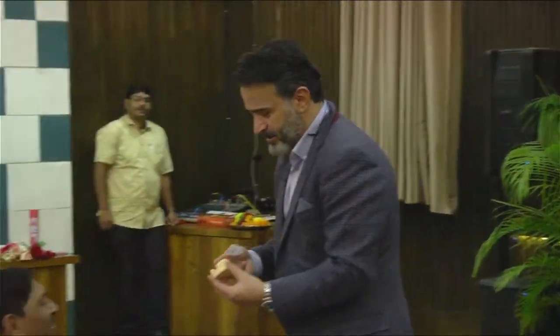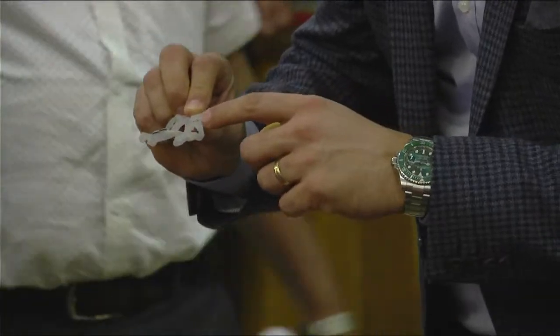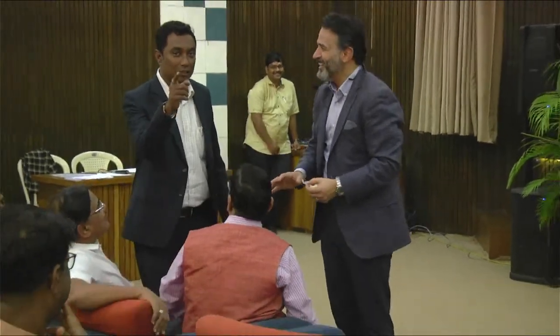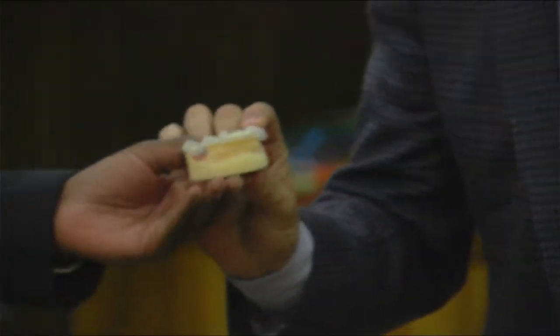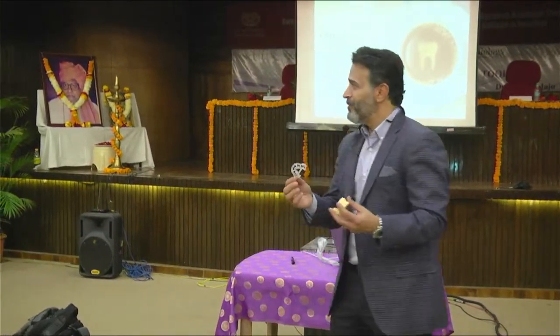Sir, this is the model, and this is the guide. You have the bridge, and you have the sleeve. So how can you do that? So what do you want me to do? Aha, the capture, okay. So capture of what? By how? Show me, okay. So this is the guide.